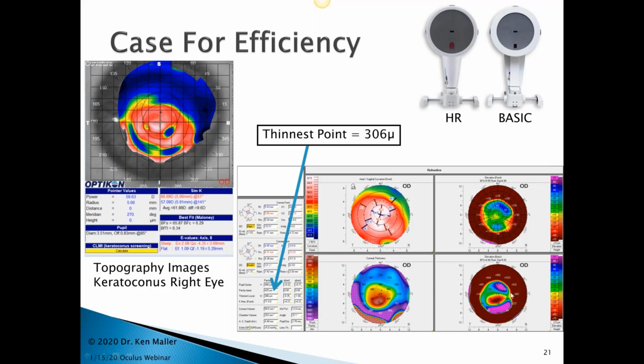And you can see here this back surface is very, very irregular, and it is going through the central portion. So if you were to take a lens and neutralize out anything that's unusual here on the front, and all of these optics came through, you can now see where some of the lens will actually fail to provide the correct visual resolution that we're trying to get.